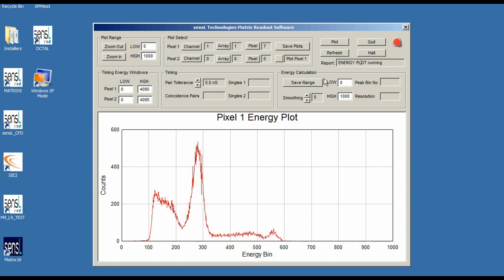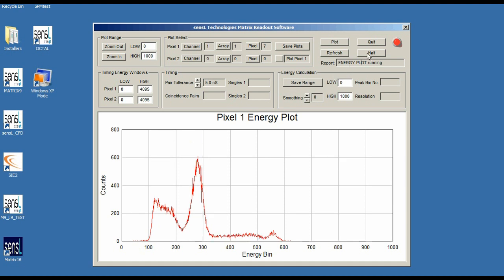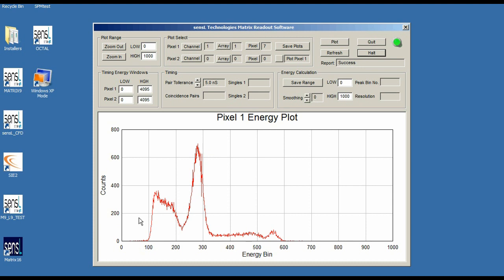I'm going to halt this graph because I'm very happy with how that looks. I'm going to select the pixel selection box here which is right beside the plot pixel 1 button.